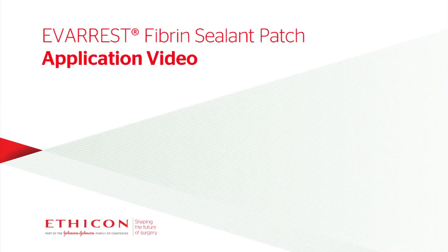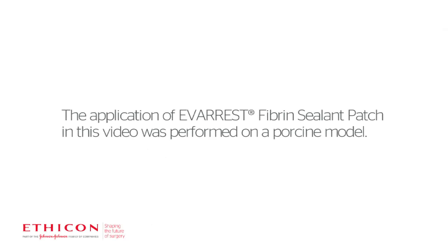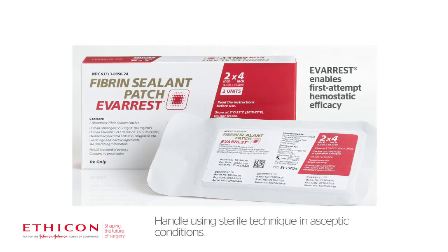EVARREST Fibrin Sealant Patch Application. EVARREST enables first attempt hemostatic efficacy right out of the box and comes in ready-to-use sterile packages.